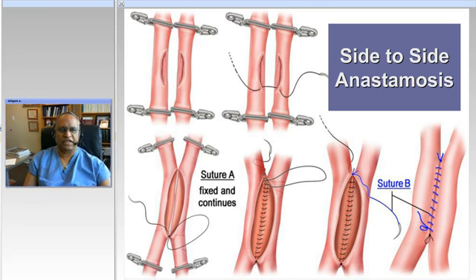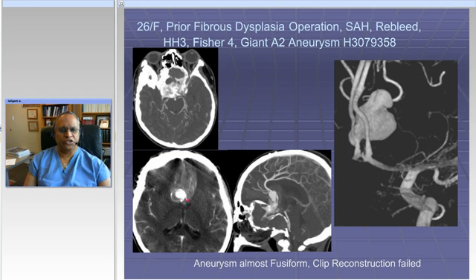So this is the technique of side-to-side anastomosis. Very nice technique to learn and use. You can find a lot of use for it.